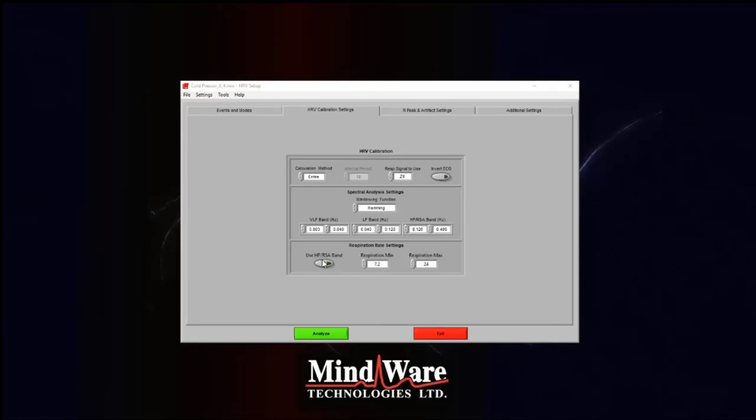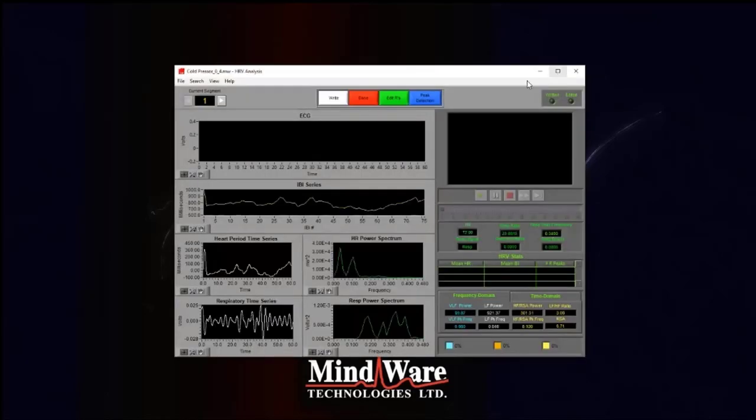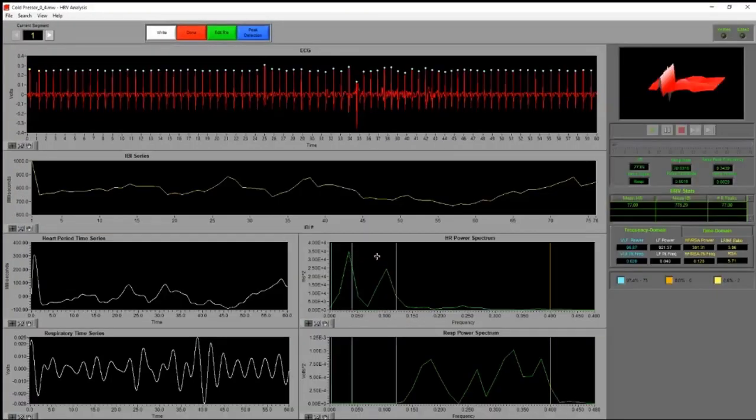I can explain why this is important. Both the sympathetic and parasympathetic nervous systems can control the heart rate in the lower frequency spectrums, so those are not as usable or relevant to us. RMSSD is simply the square root of the mean of successive differences between beats. So it's including all of the time between the beats, which includes all of this frequency spectrum information as well. Obviously, we're not reporting on the frequencies in that case.